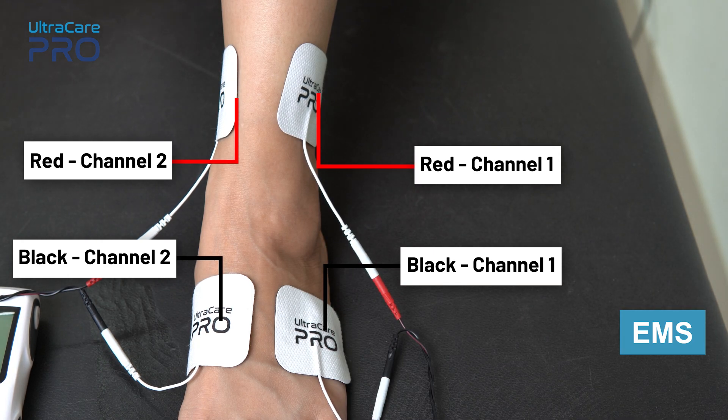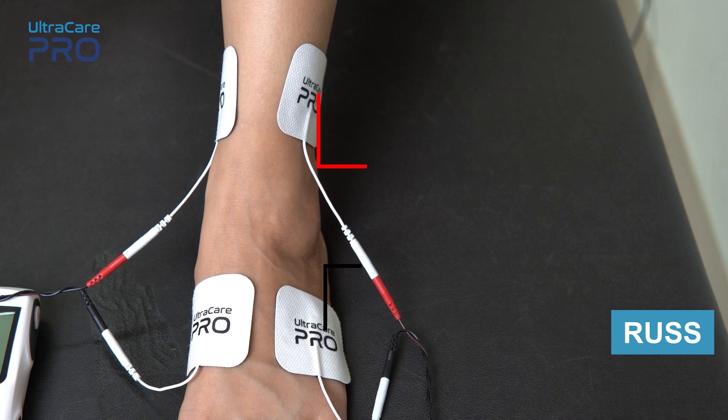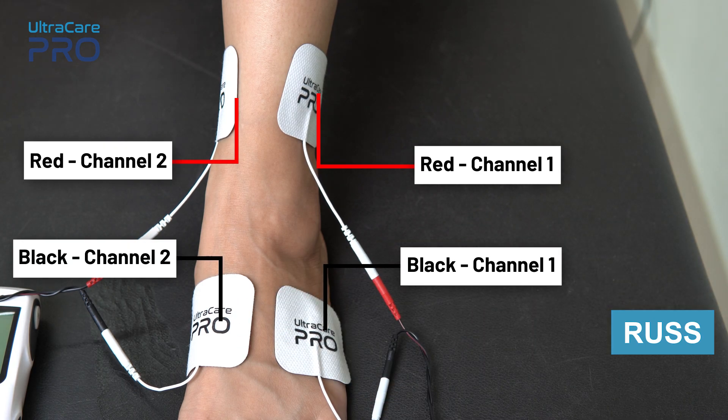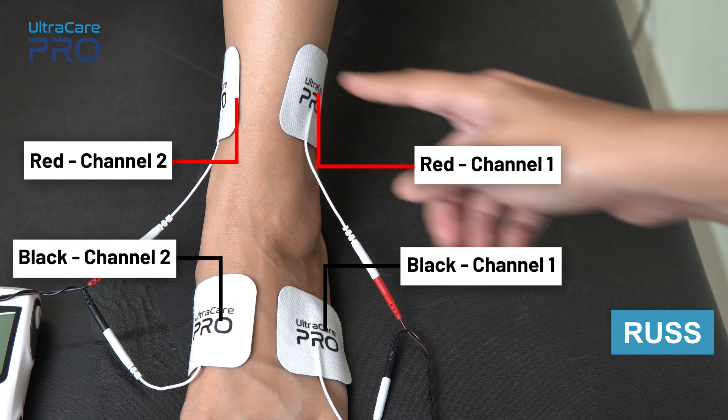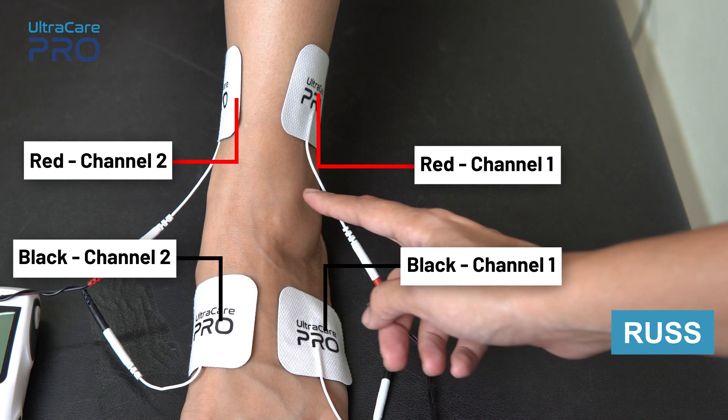For Russian current, place the red and black electrode from channel 1 on one side of the ankle joint. Similarly, place the red and black electrode from channel 2 on the other side of the ankle joint, in a way that the entire ankle is covered well. Make sure not to place the electrode on the bony prominences.